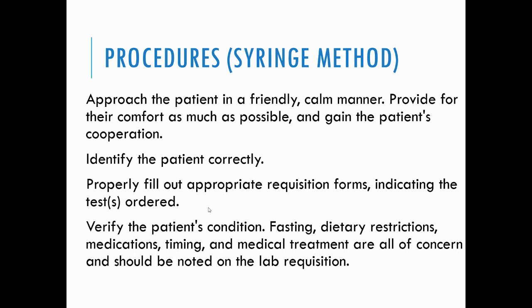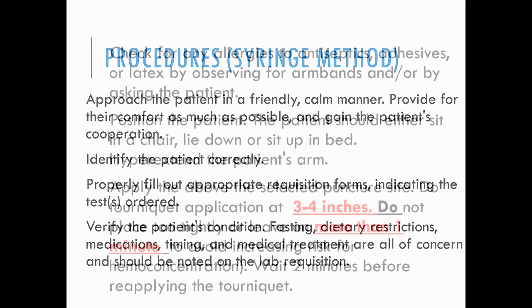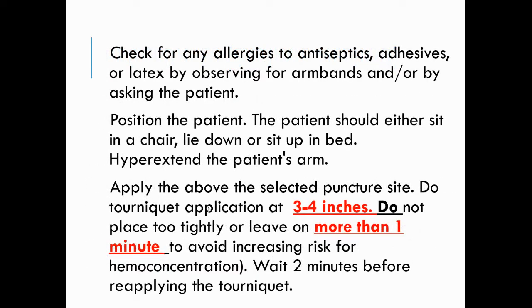So that is why it is very important nga inyo i-indicate dito kung unsa ang mga special nga mga considerations for that patient. Next, we need to check for any allergies to antiseptics, adhesives, or latex by observing for armbands or by asking the patient. And after that, we need to position the patient and make sure that the patient should either sit in a chair, lie down, or sit up in bed.